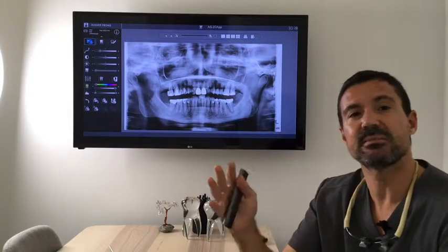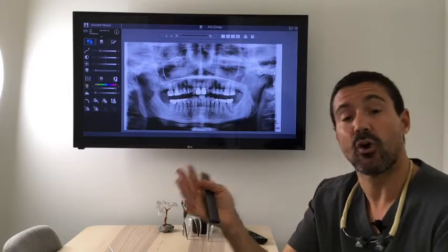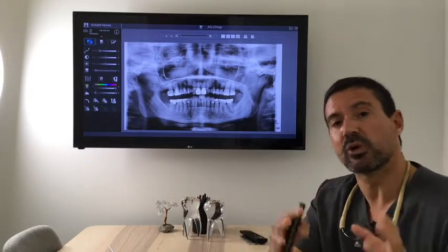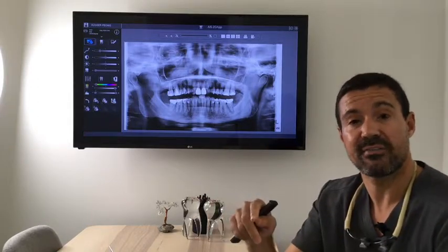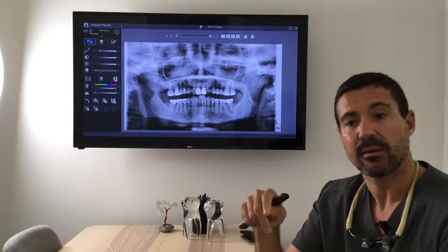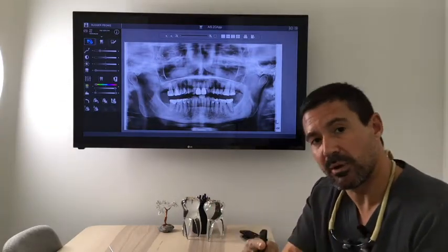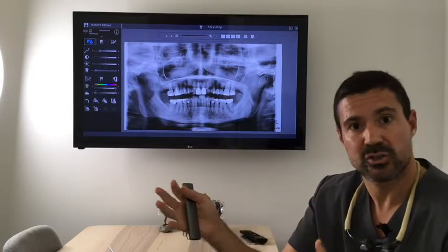I've seen so many CBCTs in my life, and in at least 50% of them, I've seen other things, not only the things that I was looking for, but other things that were developing additional problems. And this is not only good for you, but also for communicating with the patient all the problems that the patient has. And obviously that is going to have an impact on your professional development, because the patients are going to see you as a reference, because you're not only studying the problem, but you're also diagnosing other problems that the CBCT is giving you information about.